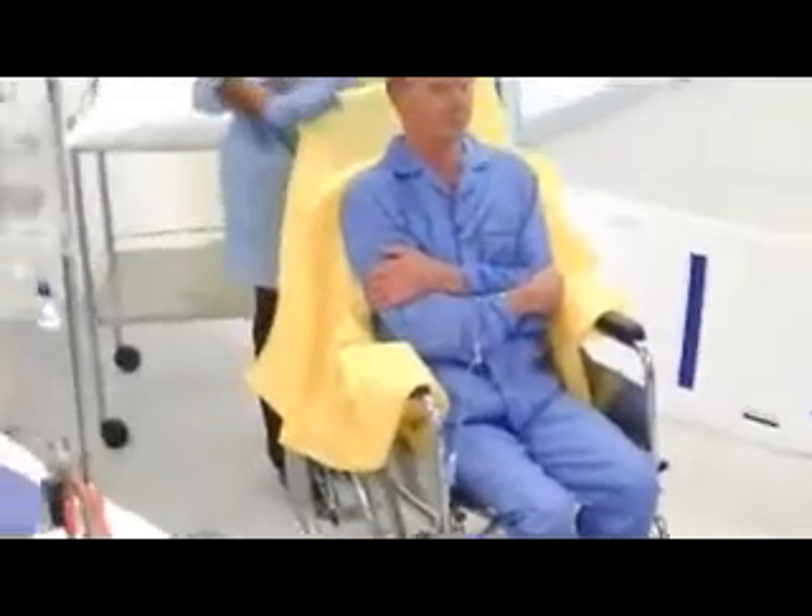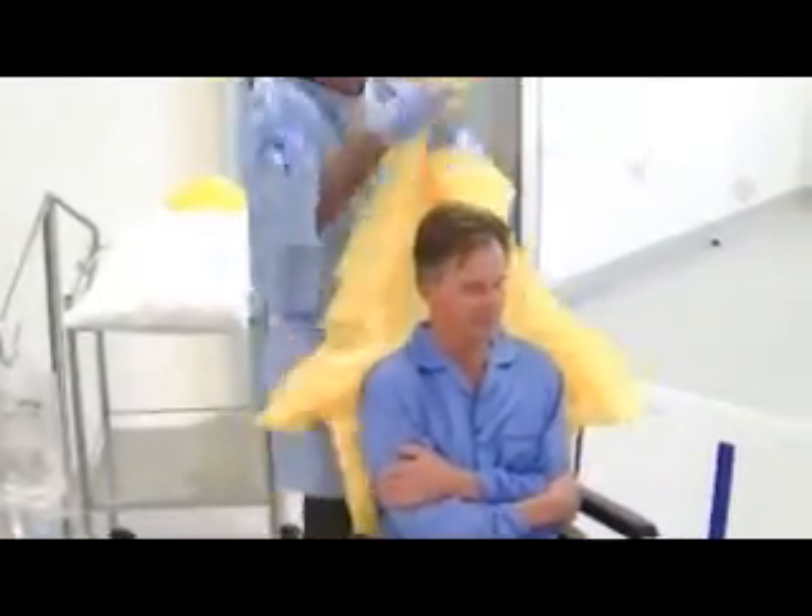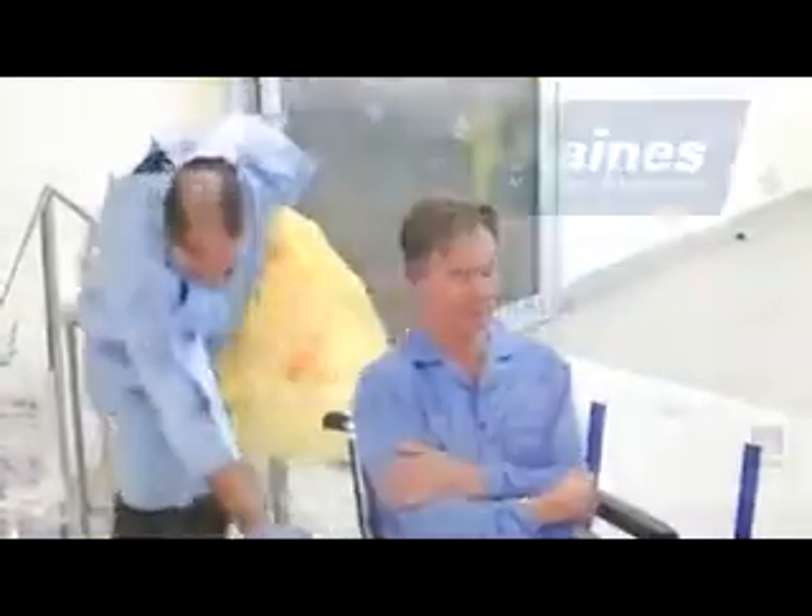Get the back of the slide sheet, pull the slide sheet up. My patient's bottom is right back in the chair.